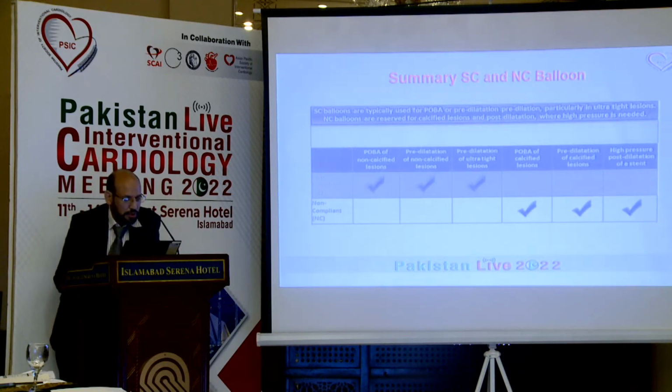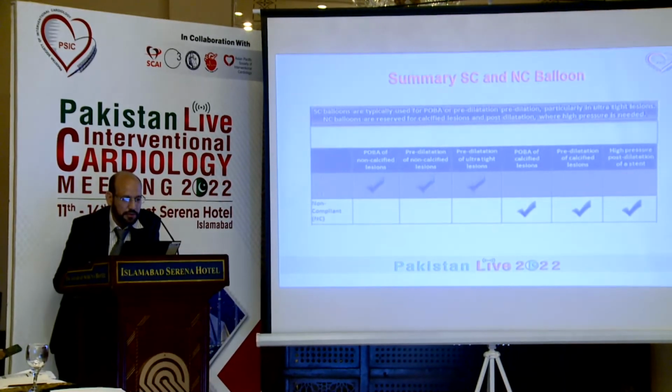So we use a semi-compliant balloon for POBA of non-calcified lesion, pre-dilatation of non-calcified lesion, and pre-dilatation of ultra-tight lesion. Non-compliant balloon we use for POBA of calcified lesion, pre-dilatation of calcified lesion, and high pressure post-dilatation of stents.